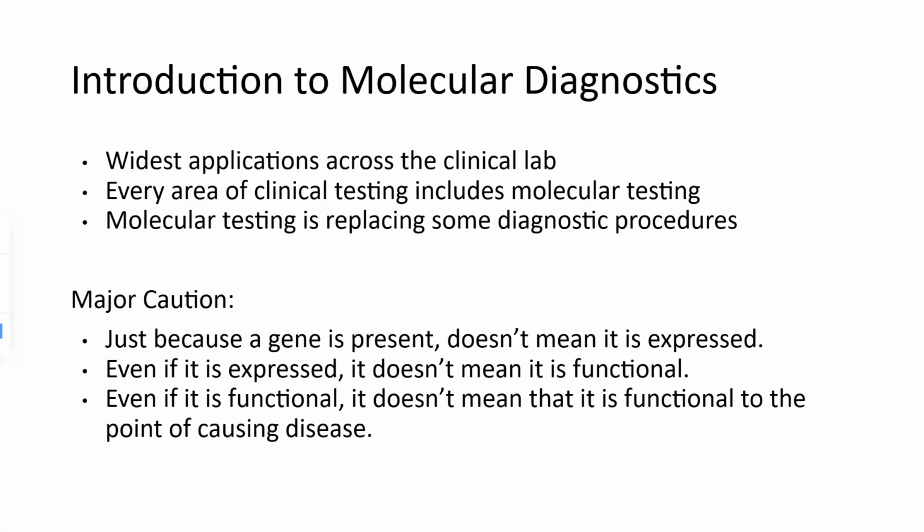Molecular diagnostics has the widest applications across the clinical lab. Every area of clinical testing includes some type of molecular testing, and molecular testing is now replacing some diagnostic procedures. So some of our typical culture methods we no longer do in microbiology because now it's all done with molecular testing. Some other areas within the lab, we replaced those tests with molecular tests because we found that testing for the genetic material was not only more specific, but gave us a lot more information about what's going on inside the person. There is a major caution here.